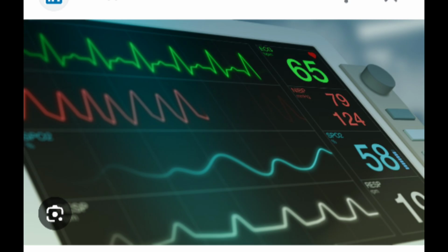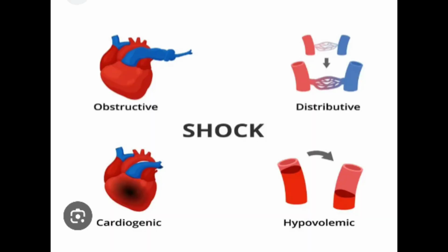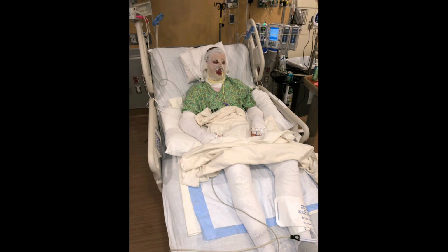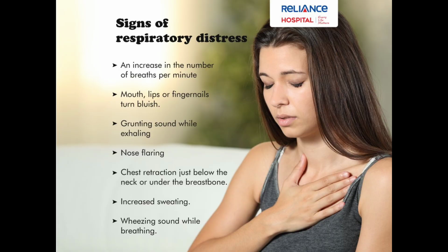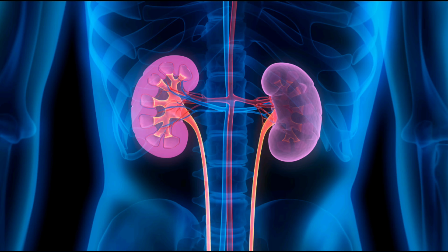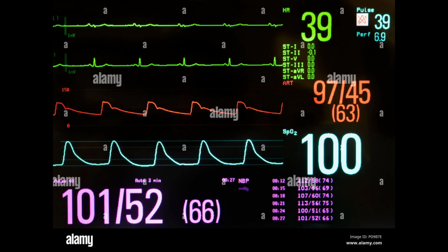So why do we need invasive hemodynamic monitoring? Well, it helps manage patients with conditions like shock, septic, cardiogenic, or hypovolemic, heart failure, severe burns or trauma, major surgeries, especially cardiac or vascular surgeries, acute respiratory distress syndrome, kidney failure requiring fluid resuscitation, and unstable blood pressure or perfusion issues.